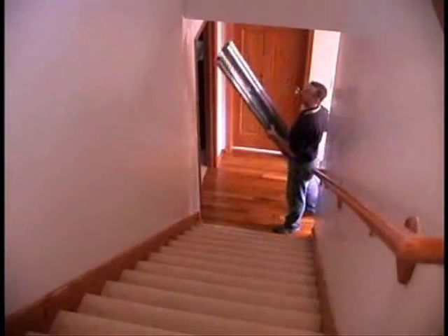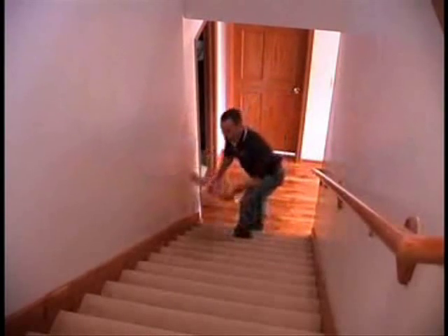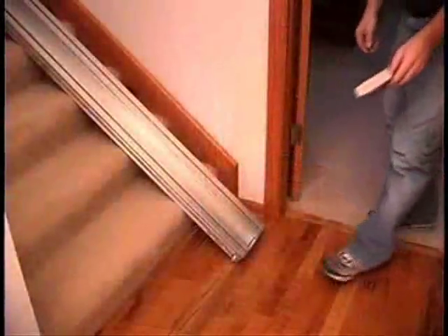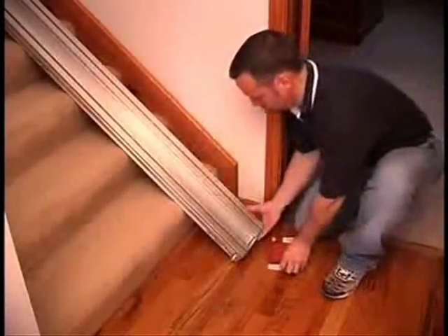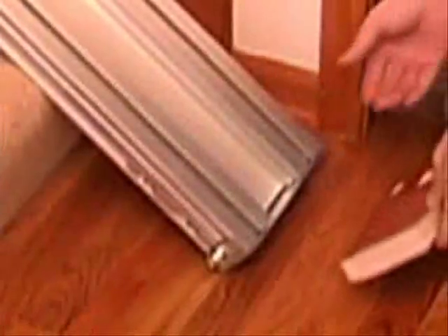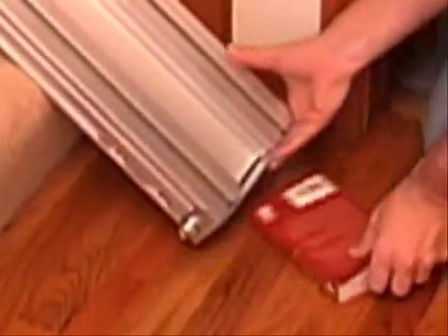Lay the track on the stairs with the metal end plate at the bottom. Set something under the bottom end of the rail to raise it one half to three quarters inch from the lower landing. This prevents the track from hitting the floor when the brackets are tightened.